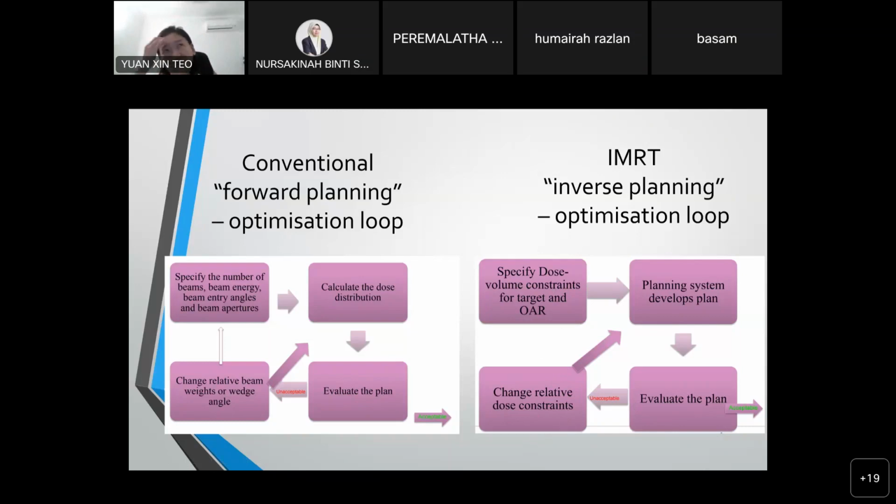You have to edit a bit your cost functions, maximum dose. This one is very difficult to say, very difficult to imagine now. I will show you later, it is better. So this optimization loop will continue until you accept your plan. Okay, are you clear on this one? I am worried you all can't imagine this one. Or maybe later I show you an example first.